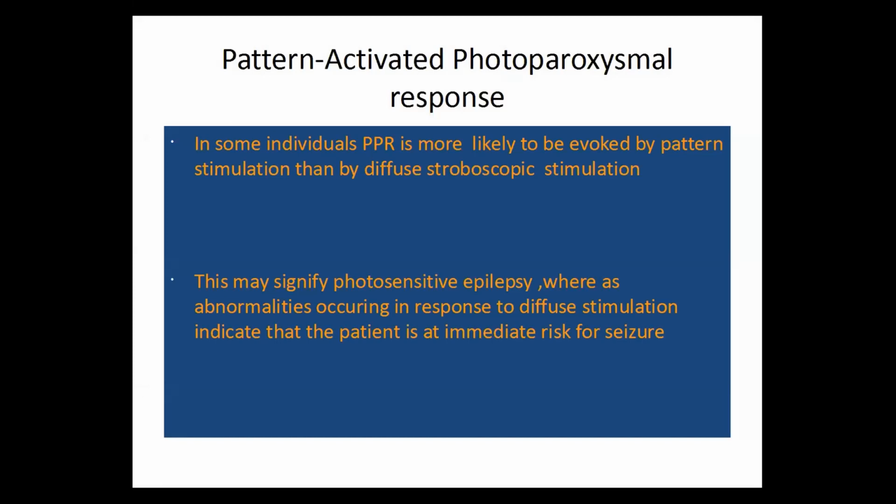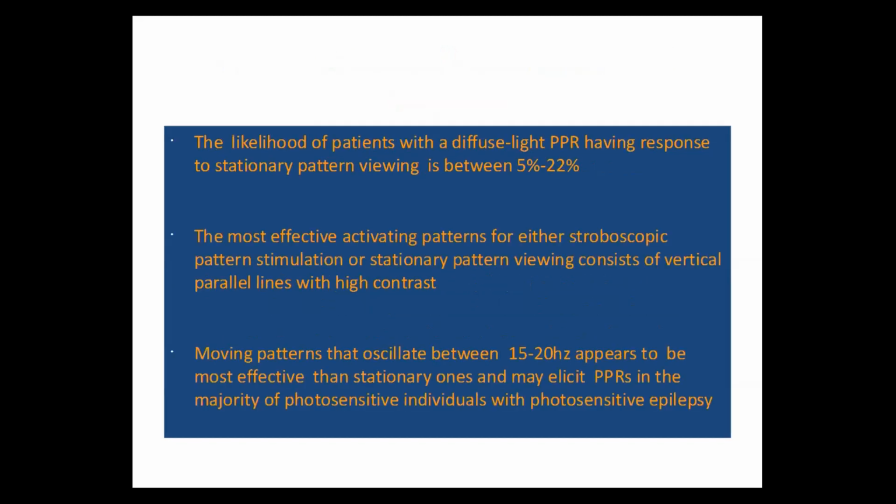Similarly, the pattern activated photoparoxysmal response, because in some individuals a pattern is more likely to evoke it than photic stimulation. The likelihood of patients with diffuse PPR having a response to stationary pattern is between 5% to 22%.